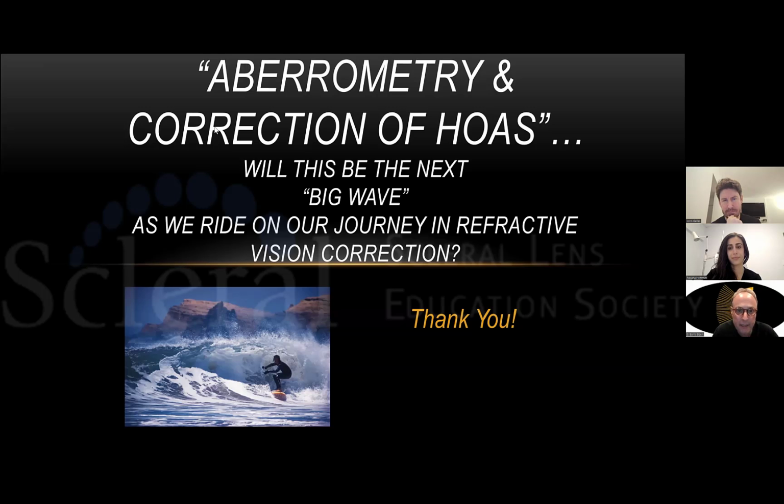Alan Wee asked, how significant is the posterior cornea? I've heard from several anterior topography people who tend to dismiss it. Maybe because they can't see it. Well, maybe because they can't sell it is what my answer would be. Of course, they'd want to dismiss it. It is significant. It is obviously not anywhere as significant as the optical influence of the front of the cornea, but we see it every day in clinical practice. Again, what you don't look for, you can't measure, you can't see, you don't know.